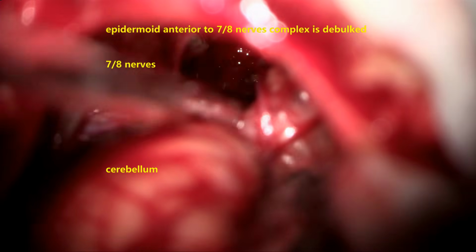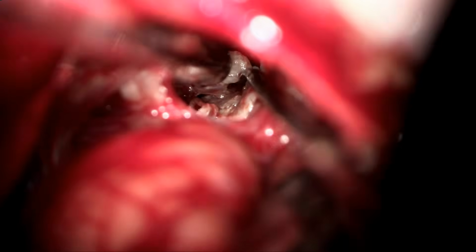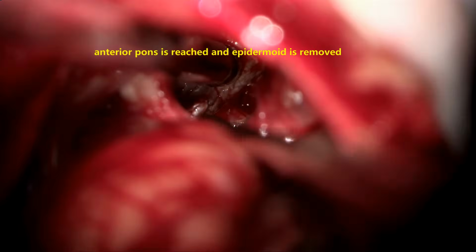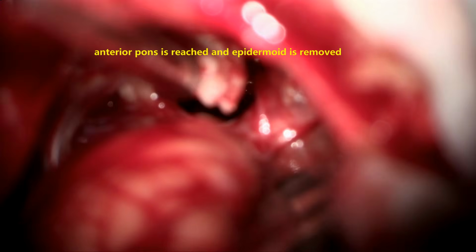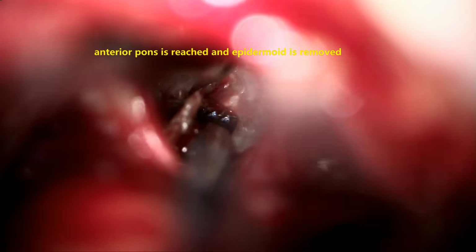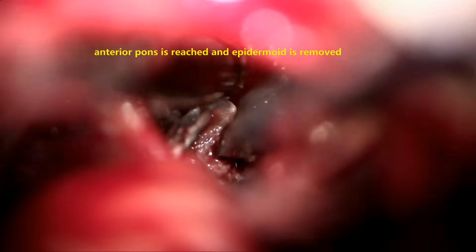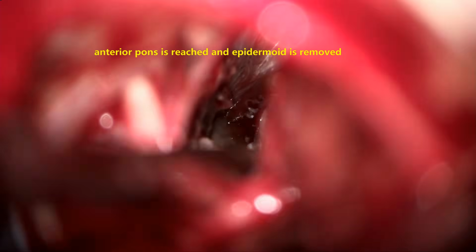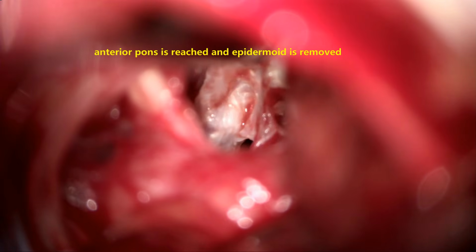Now the epidermoid anterior to the pons, anterior to the lower pons, and anterior to the 7th-8th complex is being dissected and brought out and taken out completely. That is the deeper part of the epidermoid. We are going deeper and deeper anterior to the pons, upper pons, and removing the lesion.